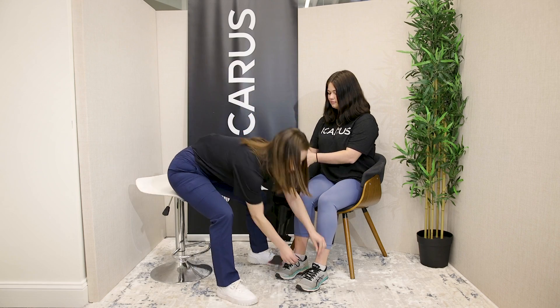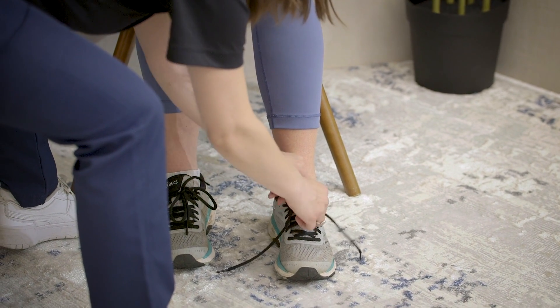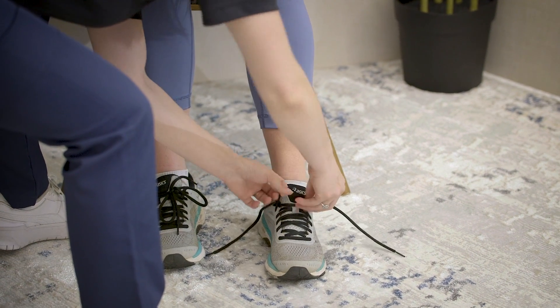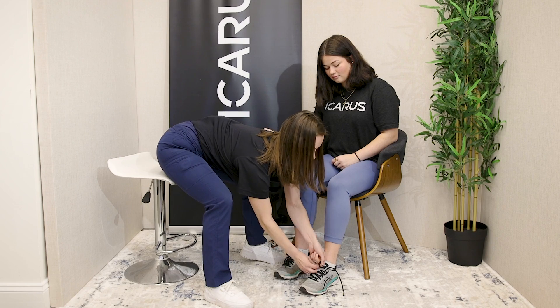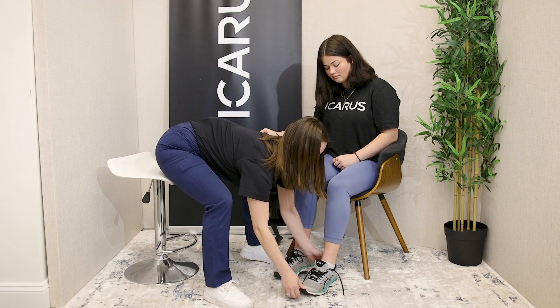The Hercules CAFO is designed to provide customized support and stability for patients with a variety of lower limb conditions. Before fitting, ensure you have the appropriate prescription and patient information. Start by communicating with your patient, explaining the fitting process, and go over the anatomy of the device with them. Address any concerns.